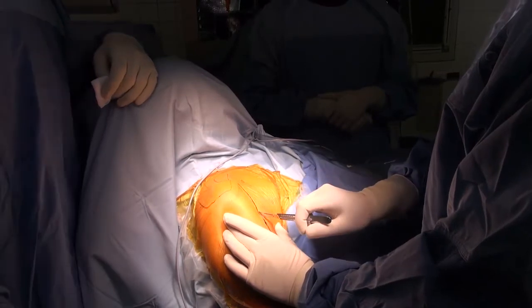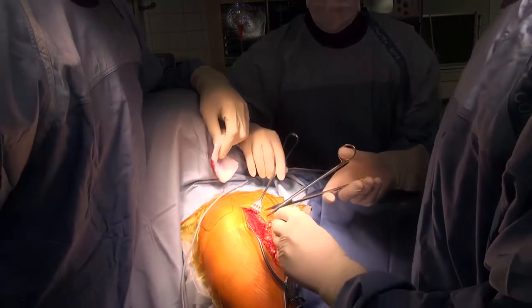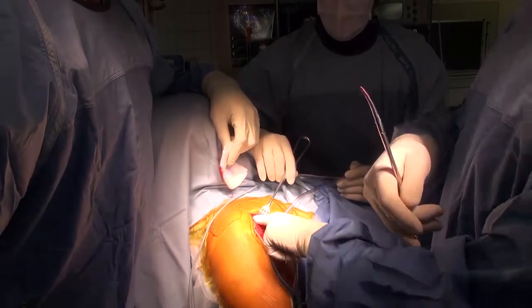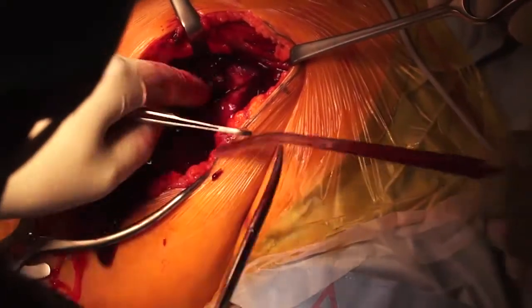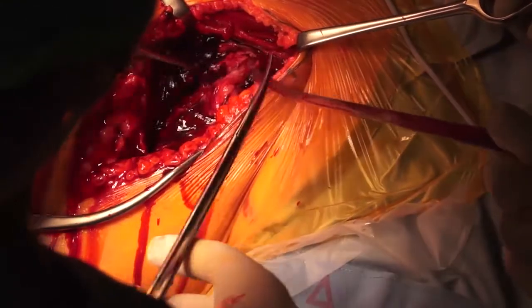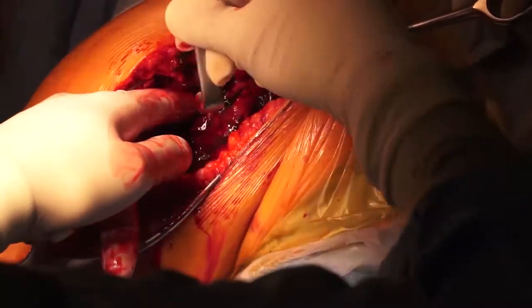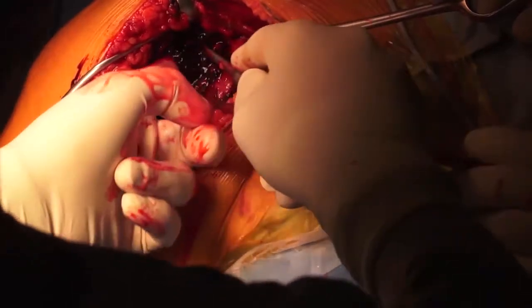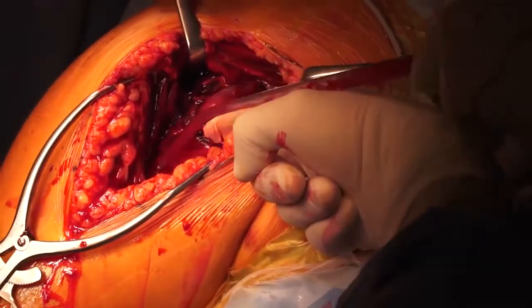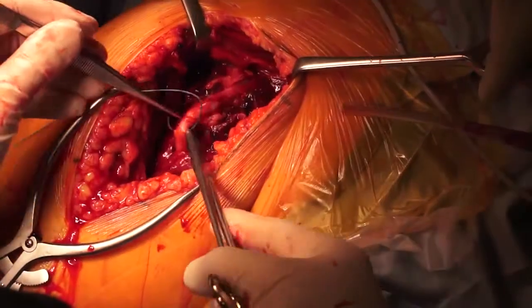The deltopectoral skin incision lies approximately 2 centimeters lateral of the deltopectoral interval. The cephalic vein is exposed and retracted laterally. The joint capsule is opened and the fracture hematoma is removed. The biceps tendon is mobilized and tenodesis is performed.